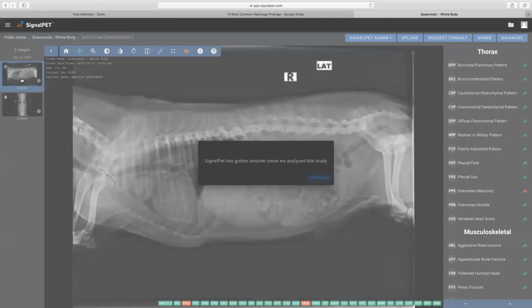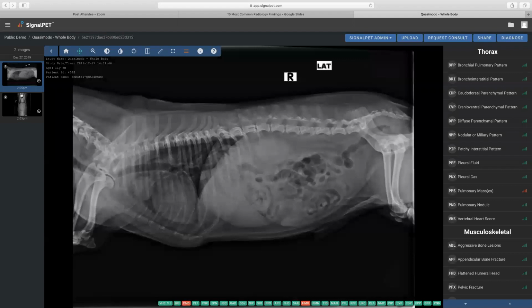outside. Needs and capabilities such as side-by-side comparison, back to home by clicking these buttons here.